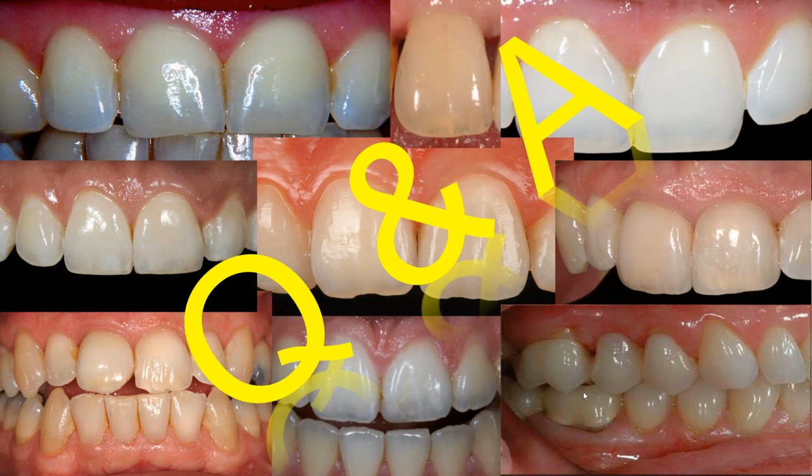And because we think that the classical shade system is the only tool that exists, I think we're afraid to branch out, expand our knowledge, to go to a different shade system. Maybe because it's an extra cost, of course. It's another $150. But when you look at it, if you combine those two shade systems together, the classical and the 3D Master, you're going to end up with a comprehensive shade selection. The possibilities are pretty much endless. You'll get a closer, more accurate shade visually, and therefore fewer remakes, and therefore less costly as well.